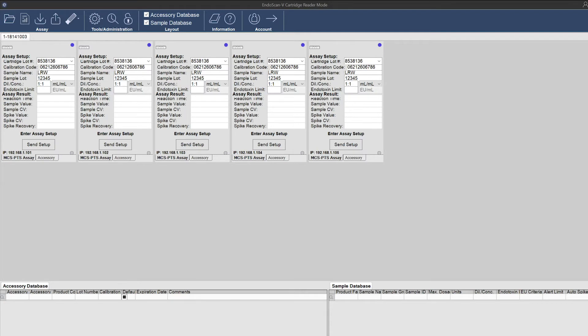Using EndoScan-V, within the first box, enter the lot number, which is the cartridge lot number on the certificate of analysis supplied with the cartridge, calibration code, sample lot number, dilution factor, and endotoxin limit if applicable. After entering your information, you are now ready to add your sample. Select Send Setup with EndoScan-V.